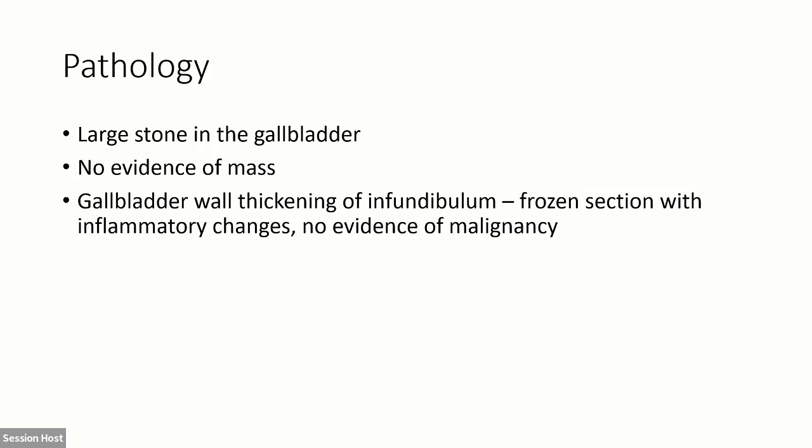For technique, I think that's a really good tip if you're just learning how to use ultrasound, especially, as we talked about in the open station, biliary ultrasound. I don't know how many people out there do gallbladders, but those of us who teach residents and fellows, just use the ultrasound on the easy cases, right? Kind of like the same concept as the robot: use a robot and gain your experience on the easy cases.